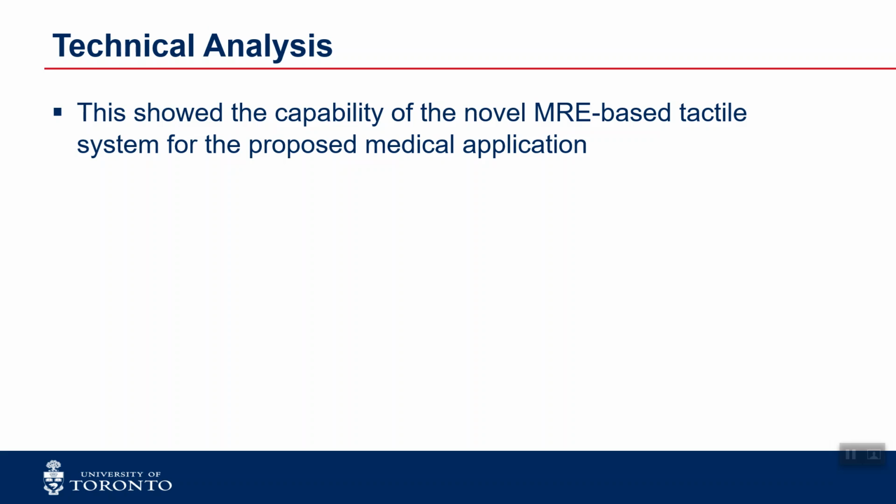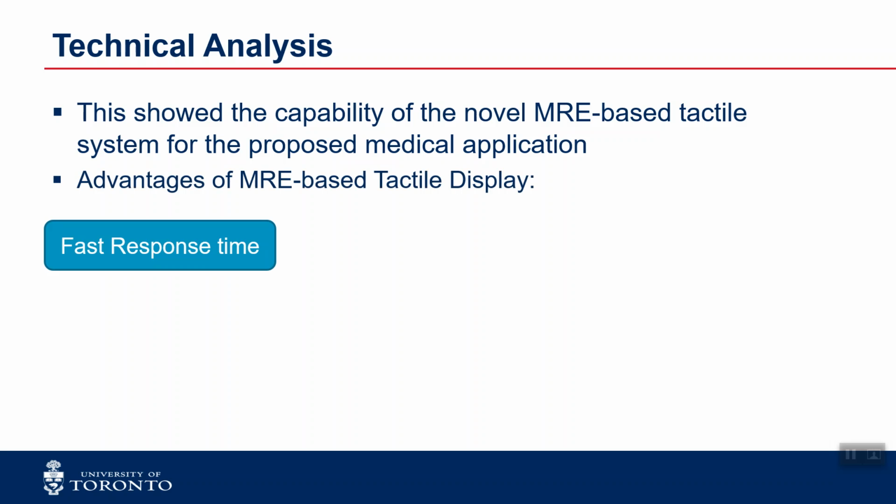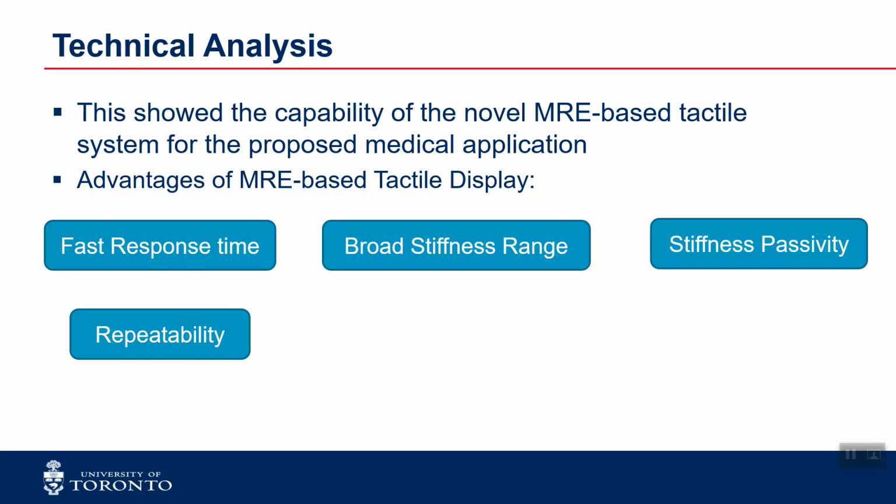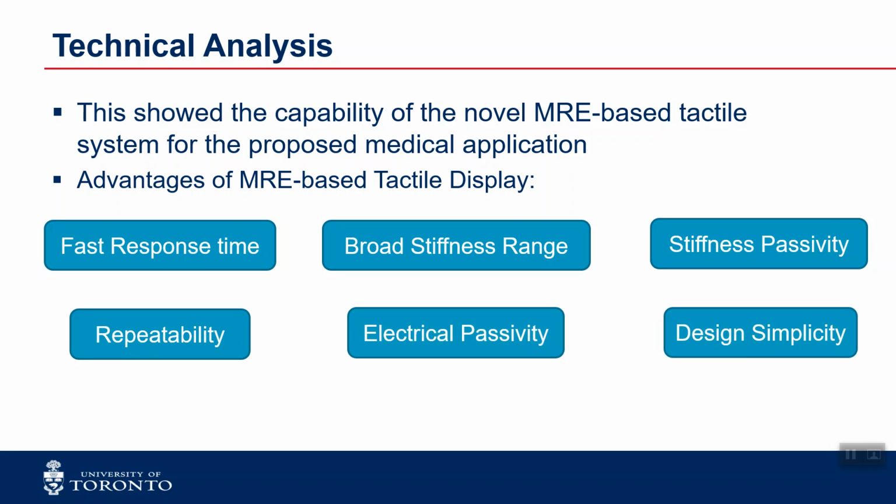This study shows the capability of the novel MRE-based tactile display system for the proposed medical application. The advantages of MRE-based tactile display can be listed as fast response time, broad stiffness range, stiffness passivity, repeatability, electrical passivity, design simplicity, and disinfectability.